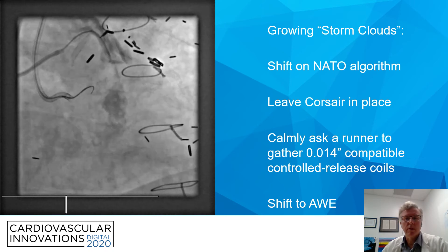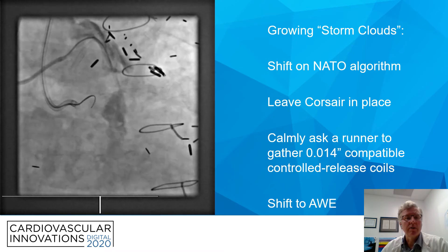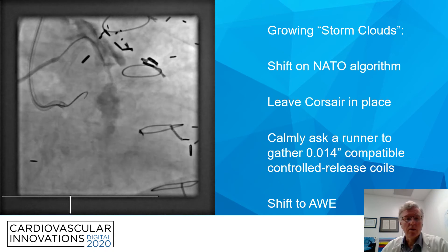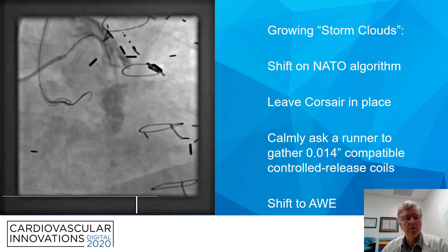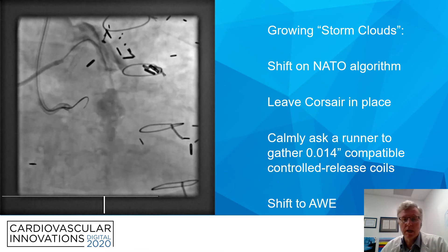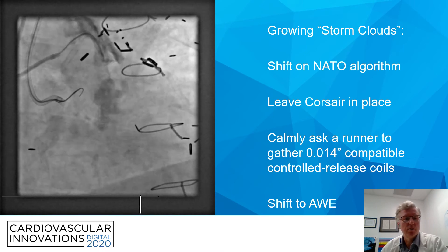This stain is getting larger — what we call storm clouds that are growing. Going into different planes, it's becoming more obvious that we've violated the architecture of this vein graft. We elected at that point to leave the Corsair in place, which is hopefully blocking the entrance to all paths outside of vessel architecture. We asked a runner to gather up all the 0.014-compatible controlled-release coils, and shifted back to the antegrade approach with this cap.